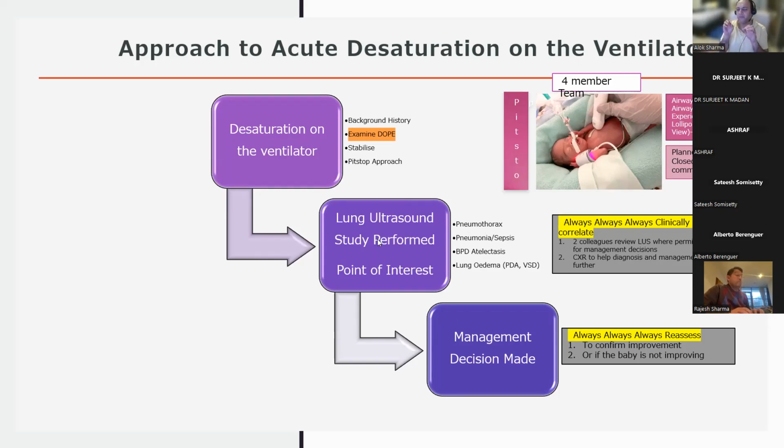Now, this comes back to how you perform lung ultrasound. In a baby where I have diagnosed a pneumothorax and I think it's getting worse, I really want to do both the right and left sides. I could have bilateral pneumothoraces. So where time permits, the risk in this situation of saying that I'm just going to do the right side, I can see a pneumothorax, oh, it's big because I've got a lung point that's in the mid axillary line. Let's needle the right side.